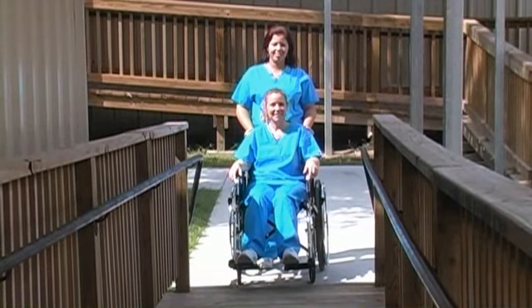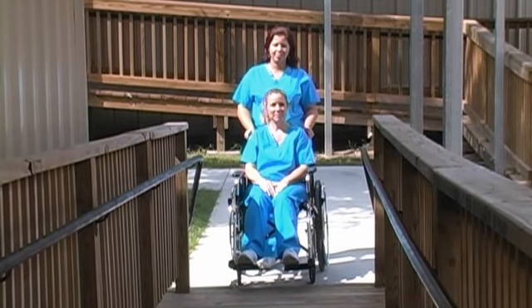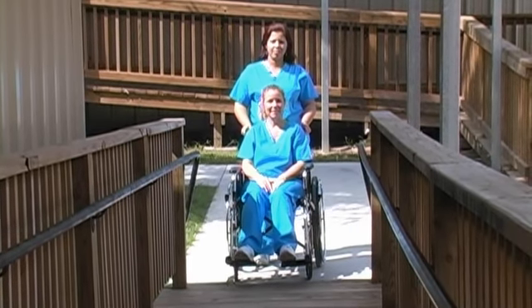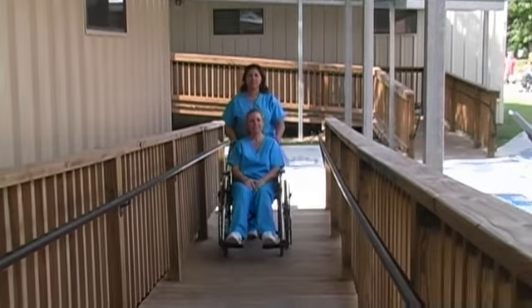For assisted wheelchair up the ramp, have client rest hands on their lap. This prevents any accidental bumping of the client's arms. Make sure client's feet are secure in the footrest. Push the wheelchair up the ramp while holding on to the handles.